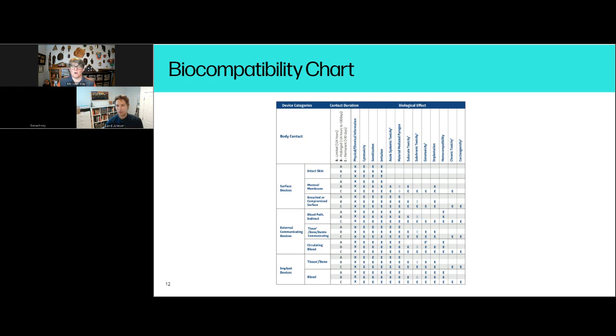Like I said, there are accreditations through A2LA. There's also, I believe, some sort of European certifications. Right now, I do a whole lot of calling people and finding out, hey, how was your customer service? Because I've had fewer problems with the actual technical issues with labs. I've had more problems with lead times, poor communication, delays, and those types of things. And those are all things that are not necessarily going to be covered under accreditation.